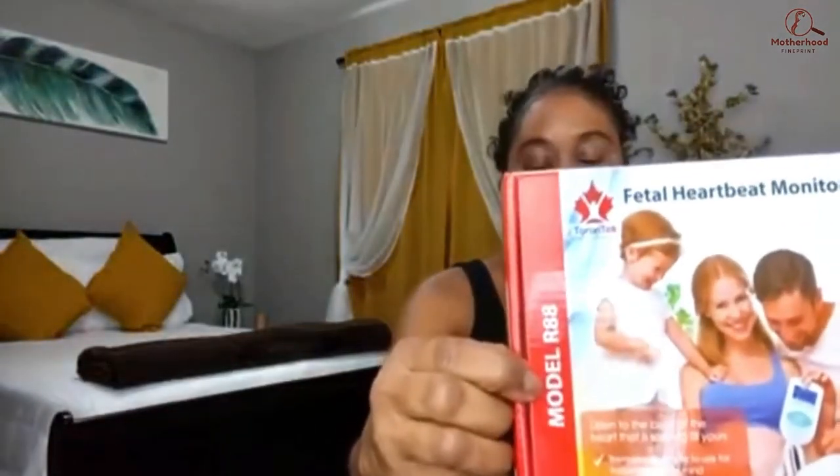This is the one that I used during my pregnancy. It's the Torrentech brand and the model is R88. I thought it would be helpful to share my opinion as well as show you guys what comes in the box.